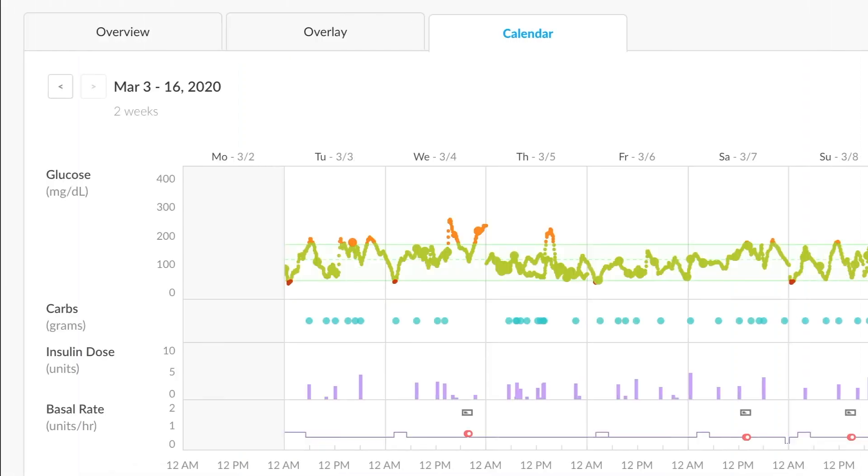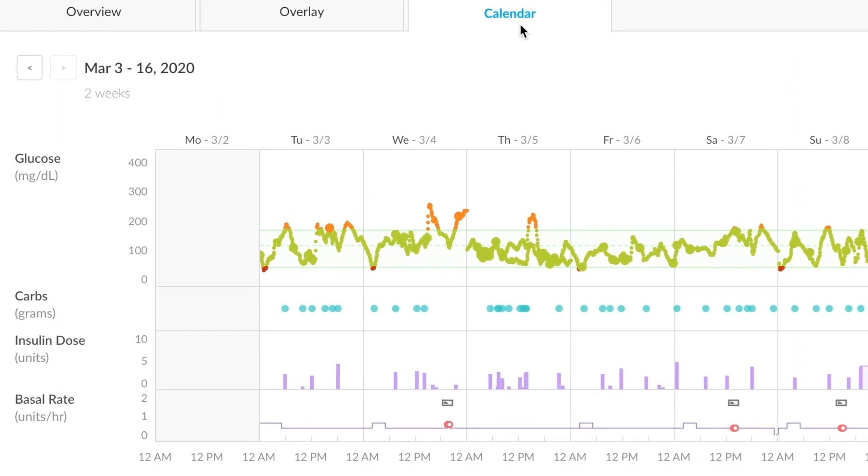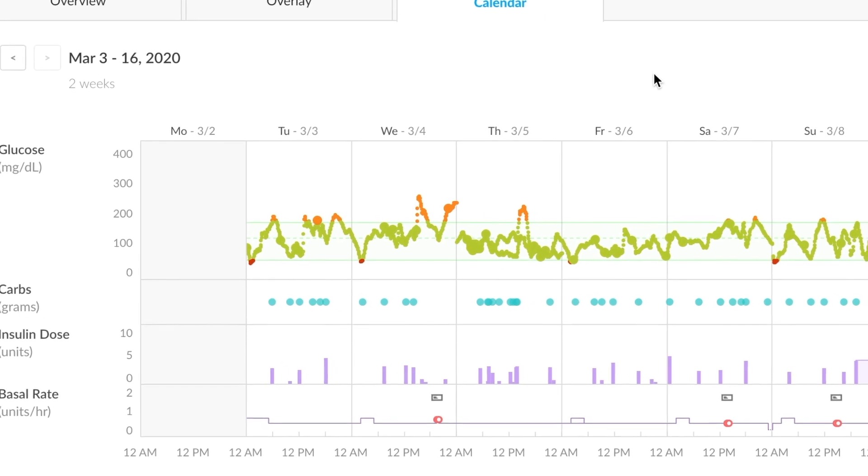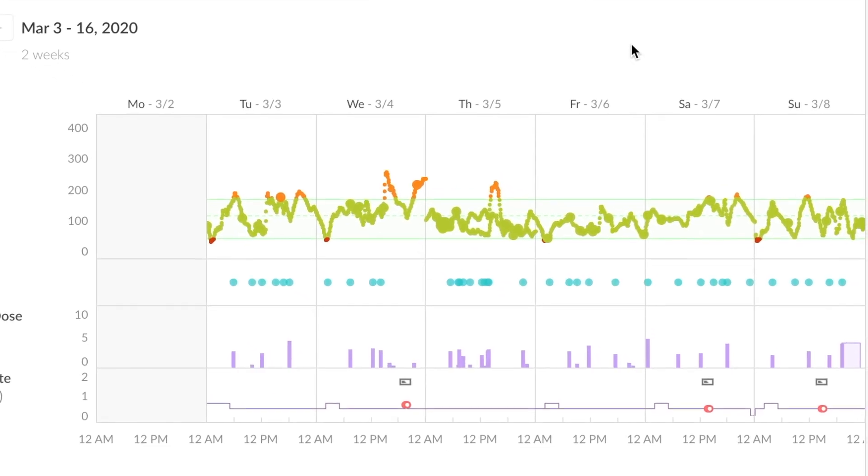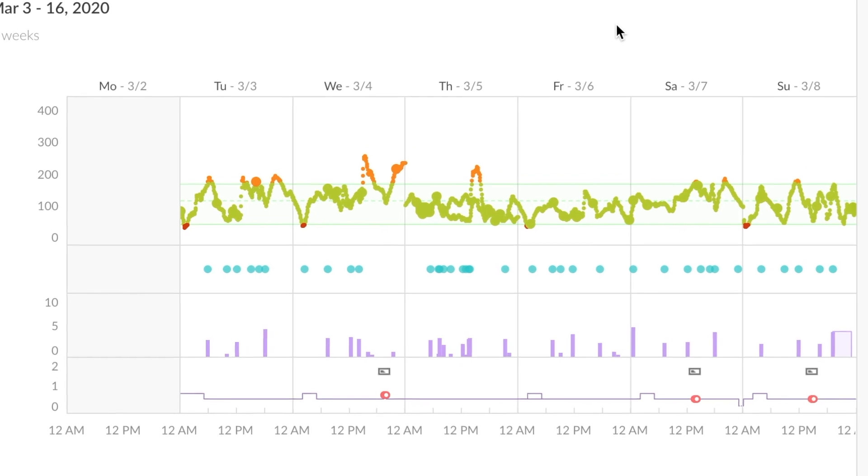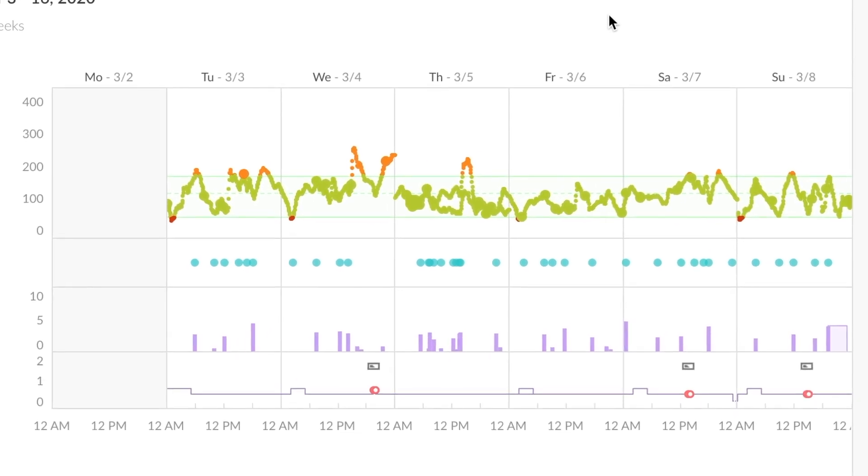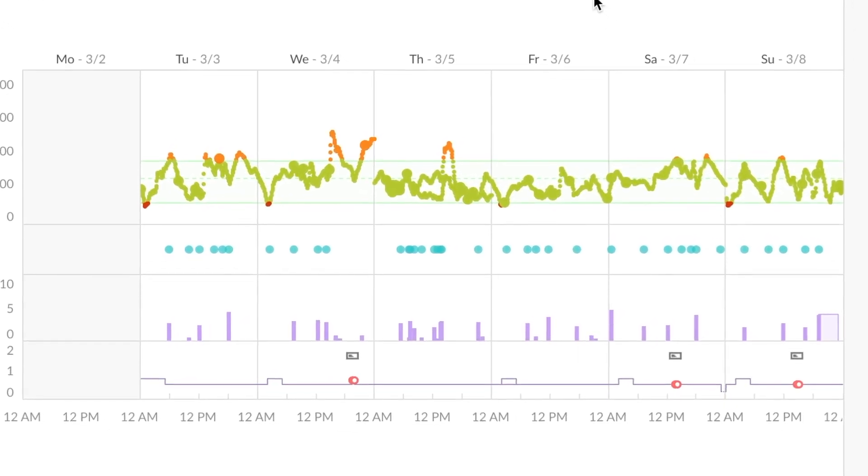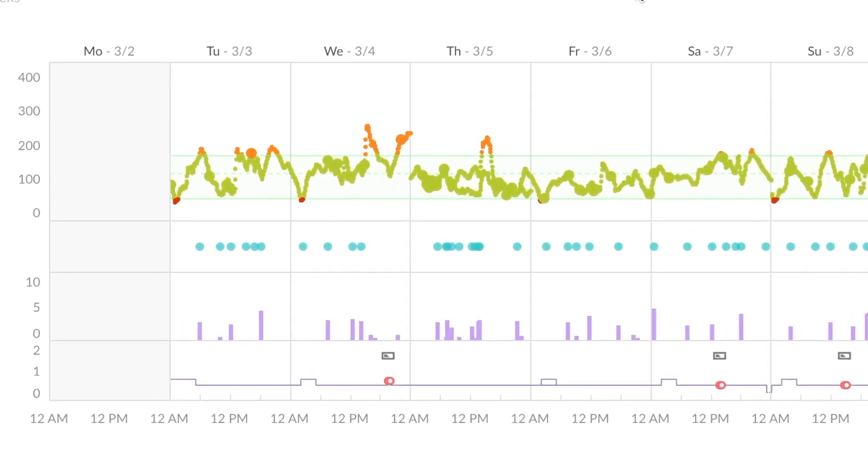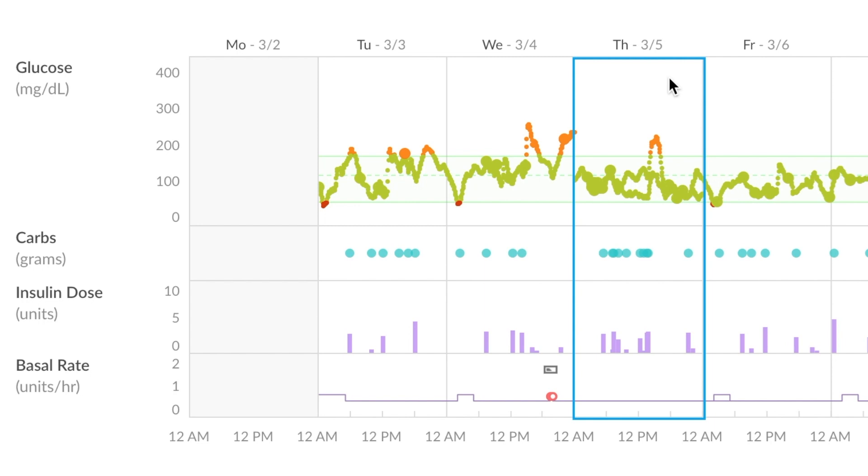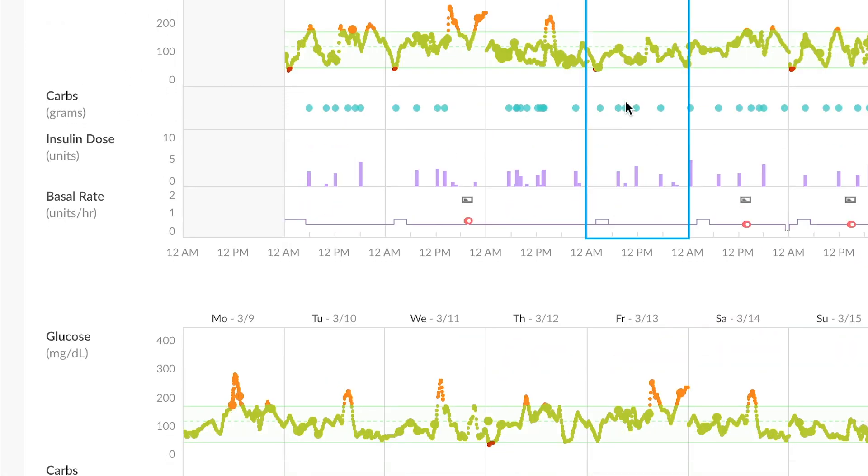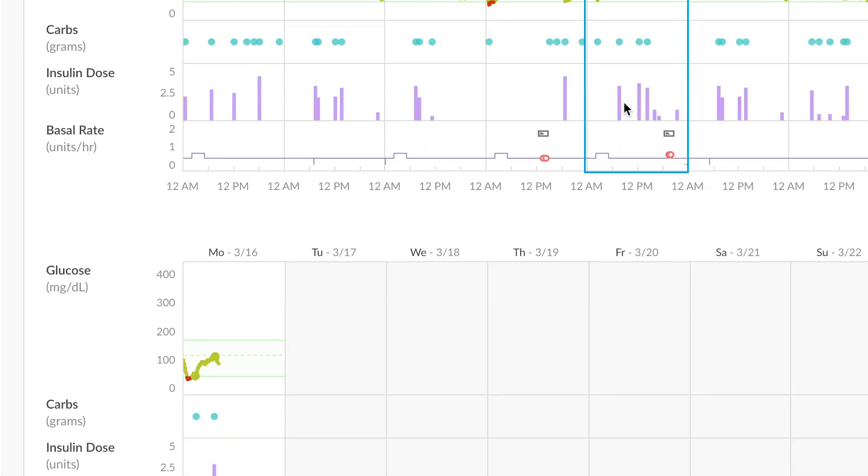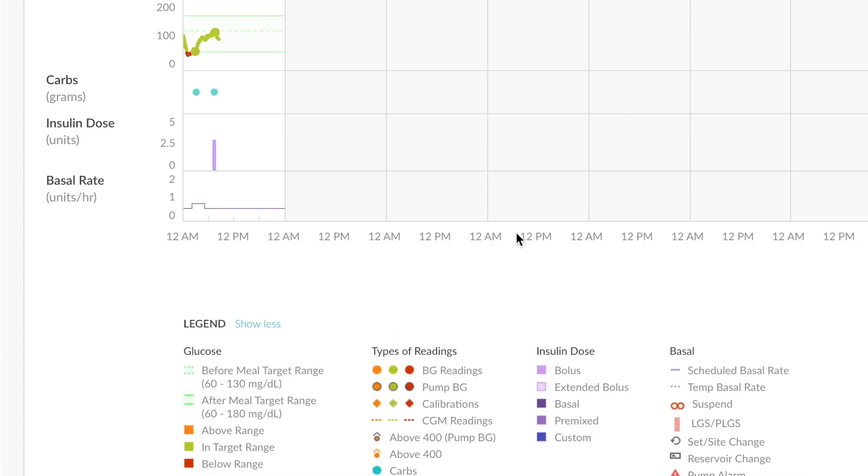Moving to the graphs calendar view, consolidates all data from all the sources that have been uploaded to the patient account. So BG values, pump values, CGM values, they'd all be represented here. Glucose, carbs, bolus, and basal rate display as stacked graphs that allow for comparison of various data points. Once again, there is a very helpful legend at the bottom that can help you out if you have any questions.